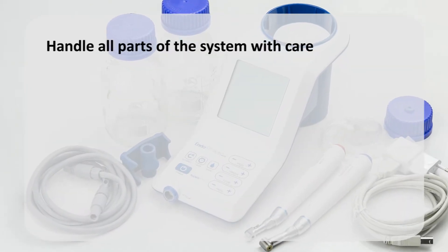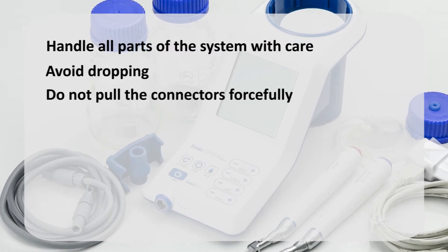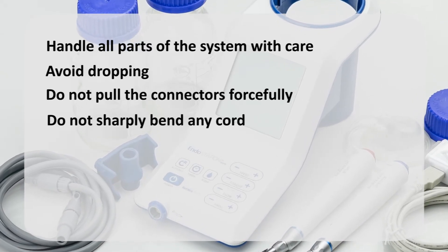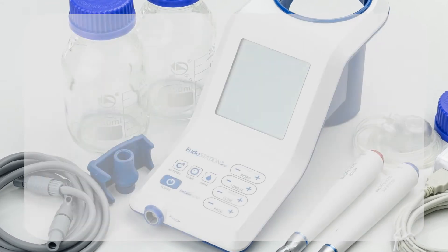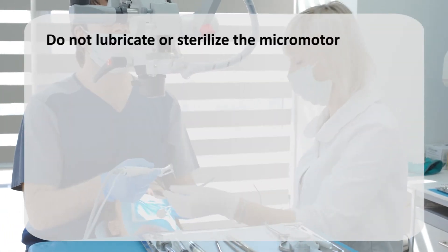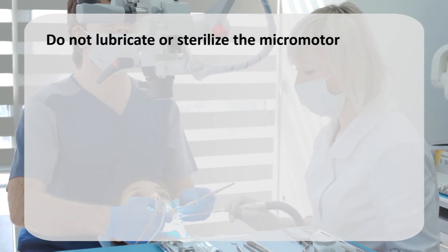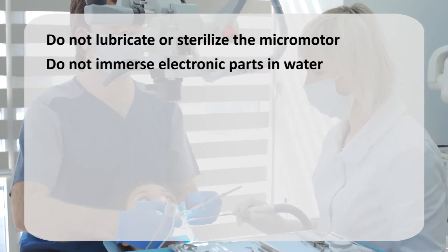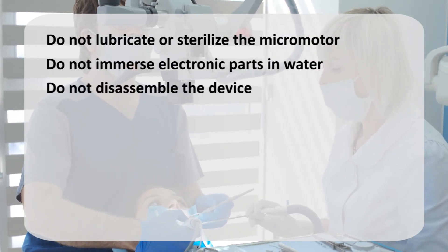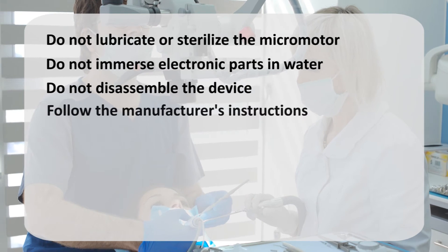Handle all parts of the system with care. Avoid dropping any part of the device on hard surfaces. Do not pull any of the connectors too forcefully or sharply bend any of the cords. Do not lubricate the micromotor or sterilize it by any means, including an autoclave or ultrasonic cleaner. Do not immerse any of the electrical parts in water or other liquids. Do not disassemble the device under any circumstances, with the one exception of replacing the battery if necessary after prolonged use. Make sure to follow the manufacturer's instructions.